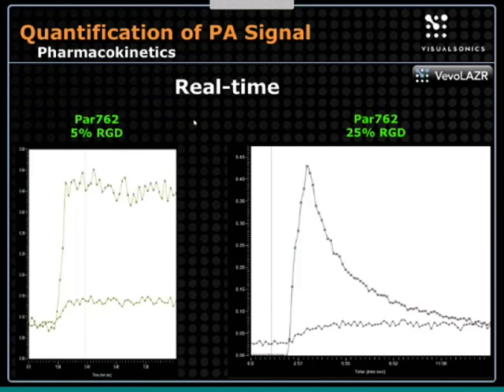So the actual values that you're getting here, if you can't read that, it's 0.5 here, and this one is about 0.45 here. So they're actually pretty close. But the actual values you're getting here are essentially normalized by area. So really, it depends on the ROI that you're drawing in this case.